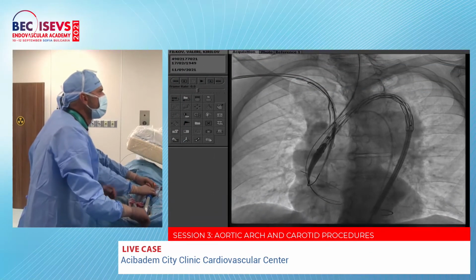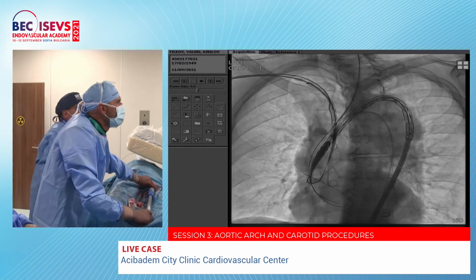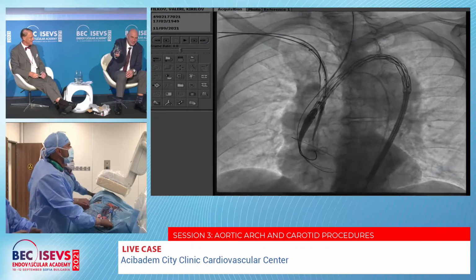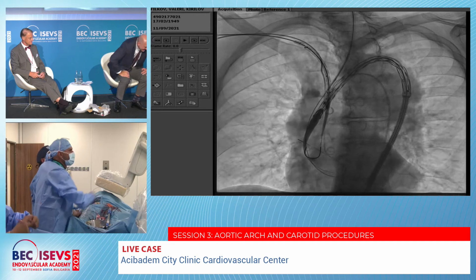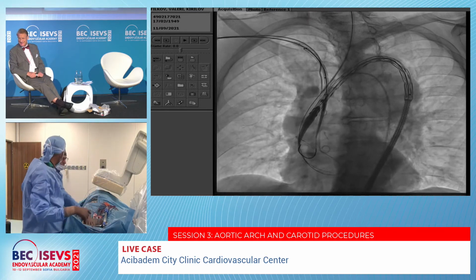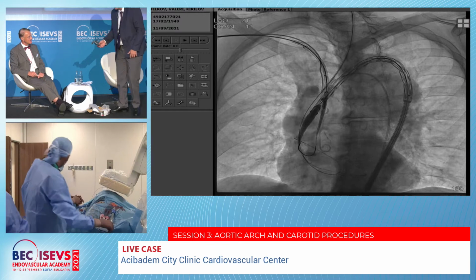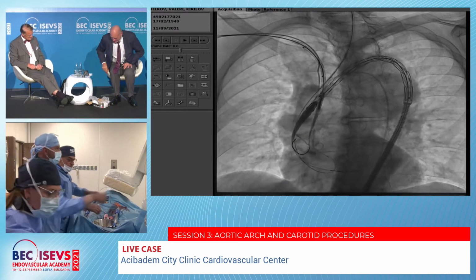I think the aortic graft is not bad. Somebody wants to touch it? To take a closer look? Yes. It's still there, that a jumping aortic arch. Not only elongated, also jumping. Probably.